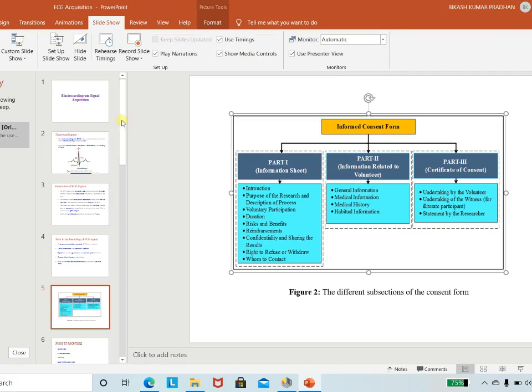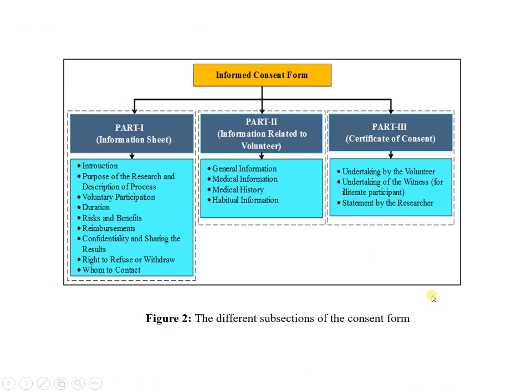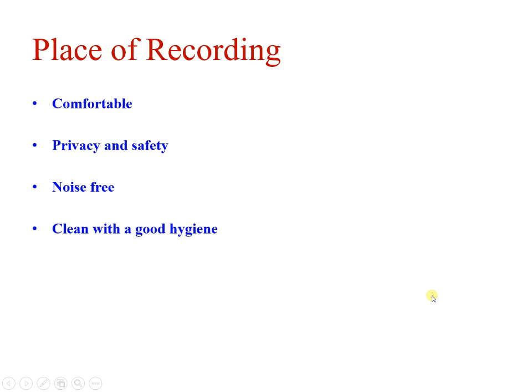Now let's move to the next section, that is the place of recording. In the earlier cases, we learned about the participant and what important factors or information you should provide or collect from a participant before recording.